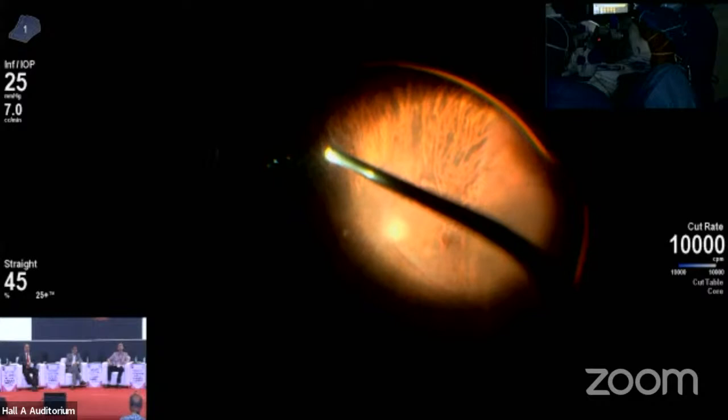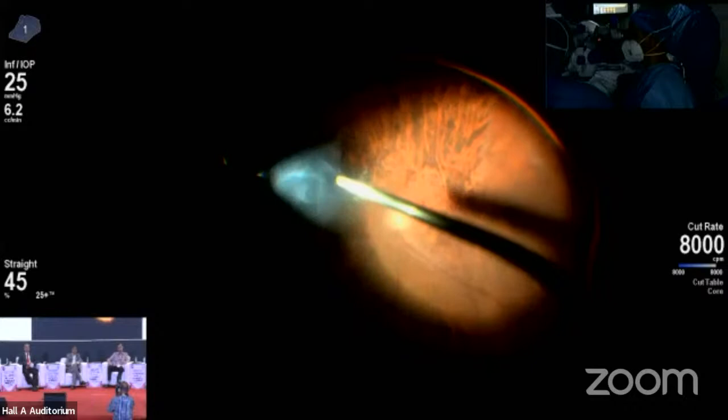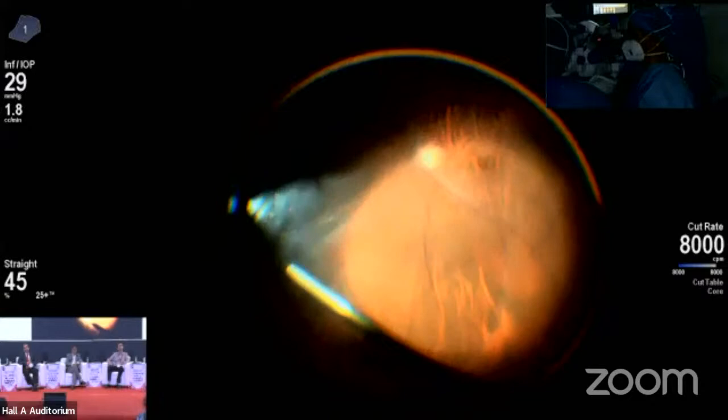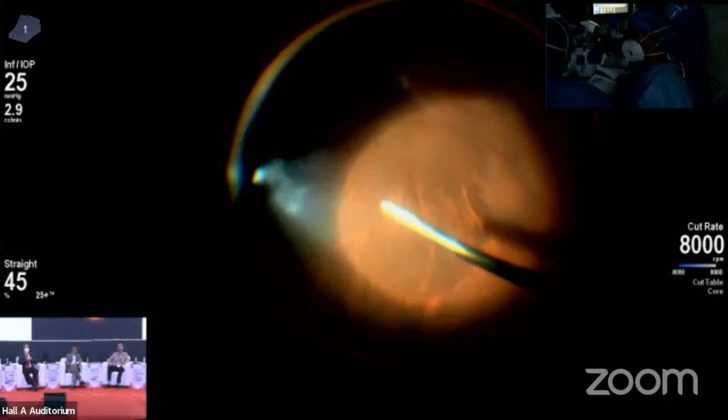Cut rate 8,000. So vitreous, especially in relatively younger patients and myopics, while it is degenerated, but sometimes it can be quite tenacious and maybe a little difficult to cut. So at the moment I am using a cut rate of around 8,000 cuts per minute and vacuum of 600. So if you can see, the vitrectomy in such cases is not very difficult, because as of now, we are very far away from the retina and most of the retina is attached.